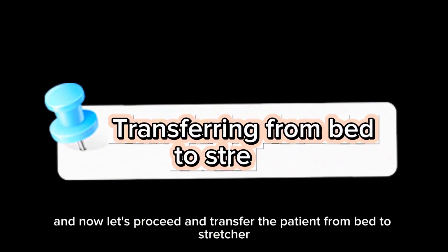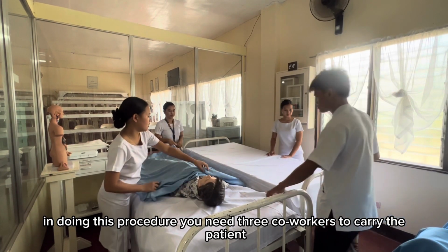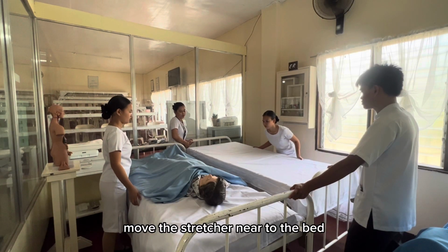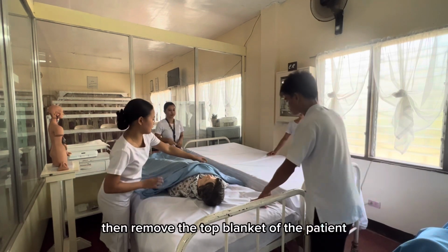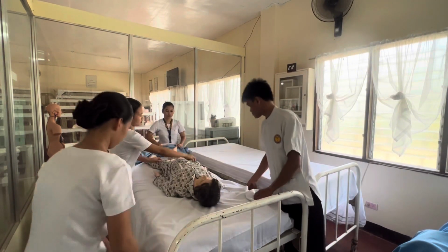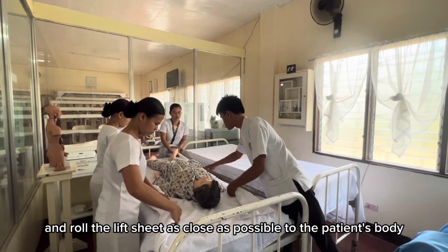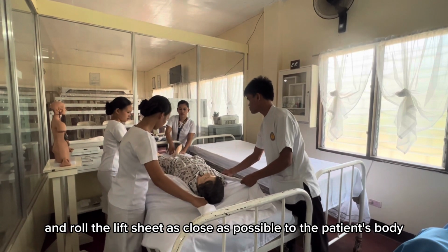And now, let's proceed to transferring the patient from bed to stretcher. In doing this procedure, you need 3 workers to carry the patient. Move the stretcher near the bed and make sure that the wheels are locked. Then, remove the top blanket of the patient. And roll the lift sheet as close as possible to the patient's body.